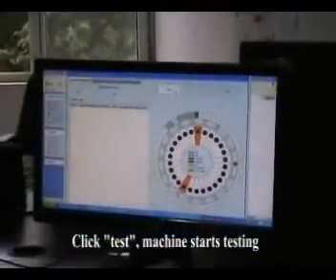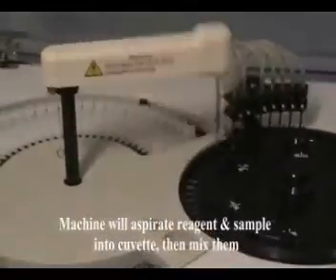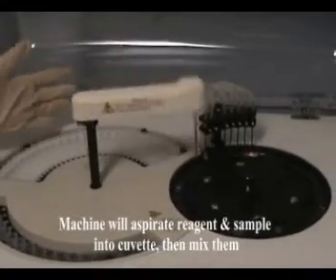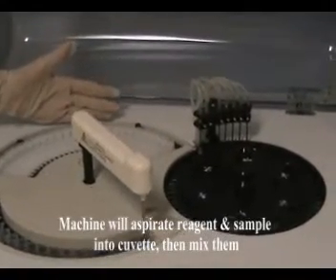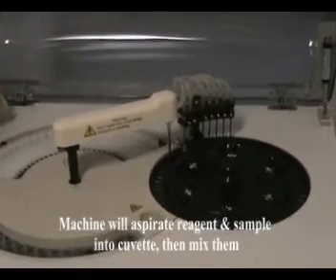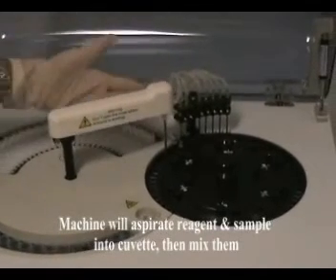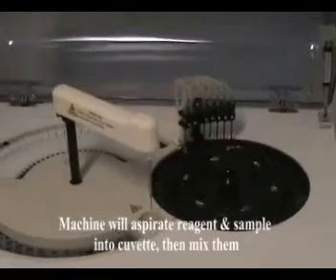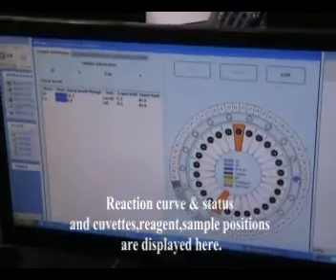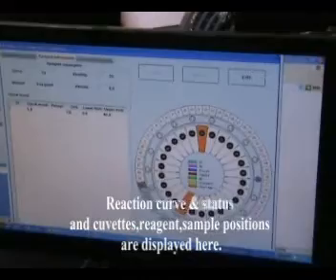Click test — machine starts testing. The machine will aspirate reagent and sample into the cuvette, then mix them. Now they are reacting. The reaction curve, status, and cuvette, reagent, and sample positions are displayed here.